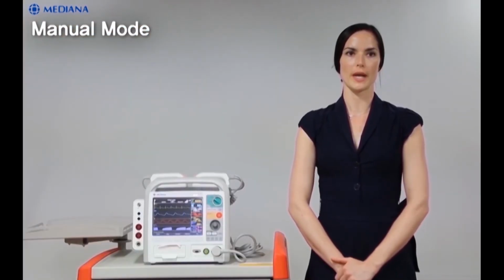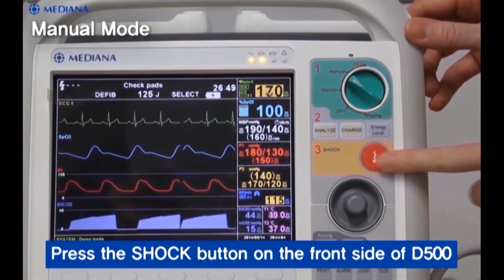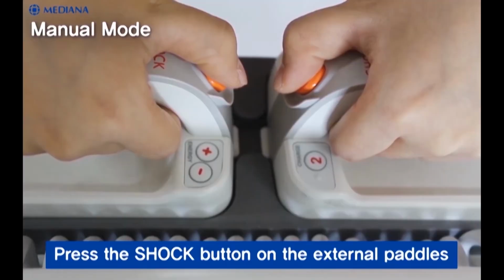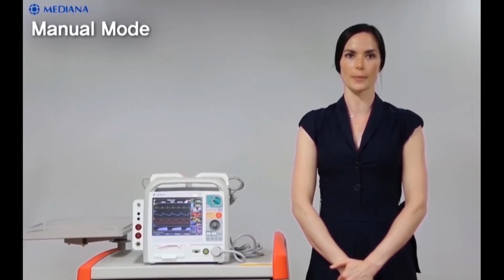So there are 2 ways to release the energy. 1. Press the shock button on the front side of D500. And 2. Press the shock button on the external paddles. Please note that the shock button on the front side does not work if paddles are used. Only the shock button on the paddles works.